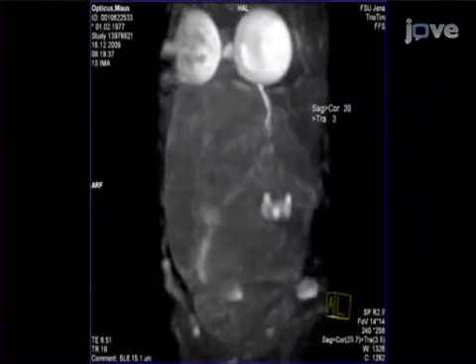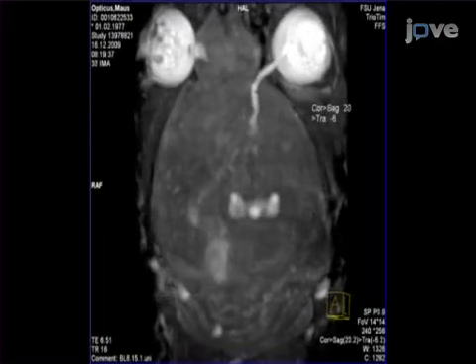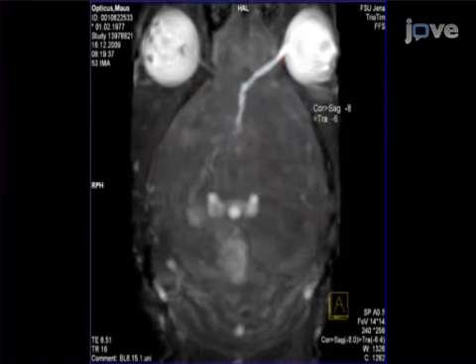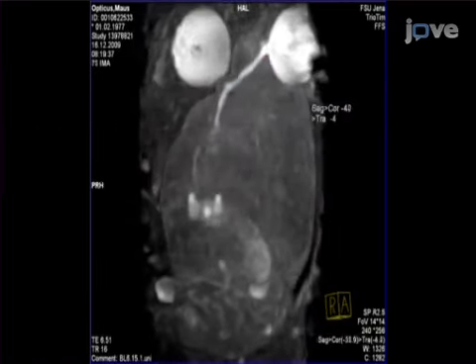Ultimately, manganese-enhanced MRI of the retinotectal projection is used to show acute or progressive neuropathologies in experimentally or genetically modified mice mimicking neurodegenerative CNS diseases.